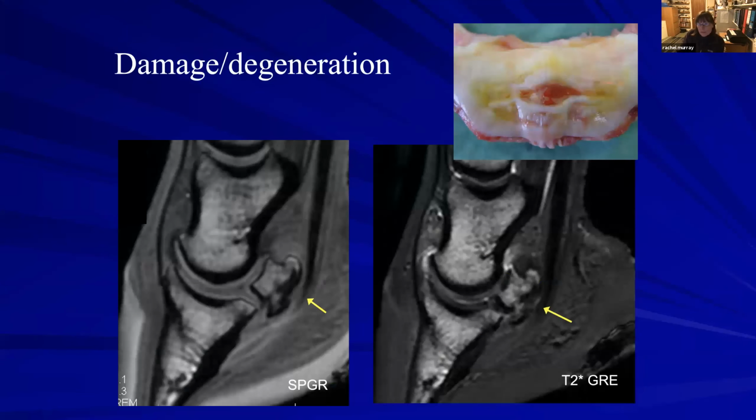So, if we have this damage and degeneration, this is a progression that we are likely to see on MRI. If we MR our horse with high signal intensity on fat suppressed images, and then we re-MRI it at a later point, we are going to have an idea about whether this has got deterioration going on.